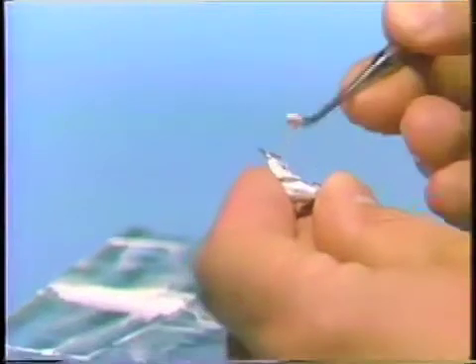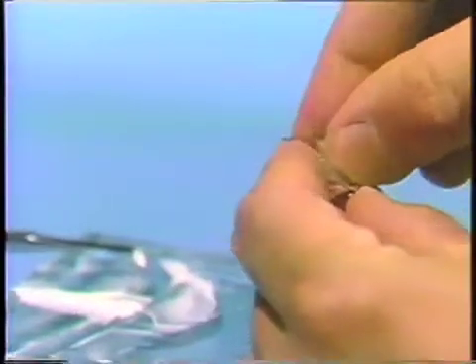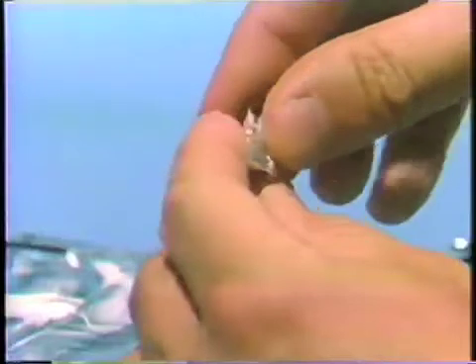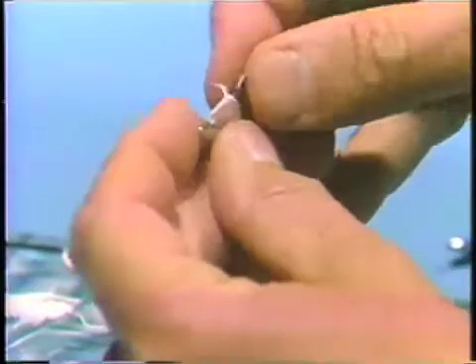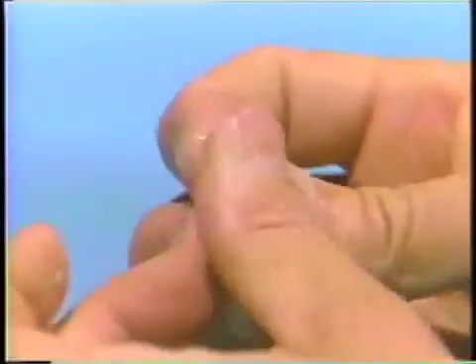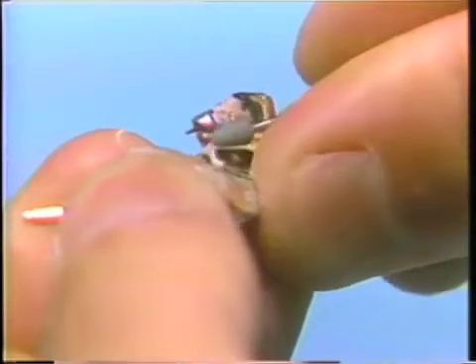Extra cement is placed on the gold surface and then the facing is carefully placed. Care must be taken not to put too much pressure on this delicate bridge because it is fragile and you can distort it or bend it if you're not careful. When it is seated all the way, the excess cement is wiped away and the margins and the pins are burnished and finished.